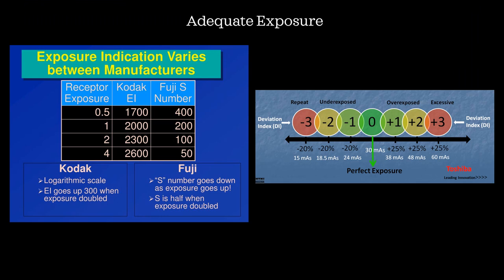Adequate exposure reached the IR. Were the technical factors of mAs and kVp appropriately set for the projection? Is the EI number attained at the ideal level or within the acceptable parameters of the digital system? Does the projection demonstrate quantum noise? Is there a decrease in contrast and detail visibility caused by scatter radiation or fogging? Was a grid used and recommended? And if so, was the appropriate grid ratio and technique used for the grid? Are grid line artifacts demonstrated?